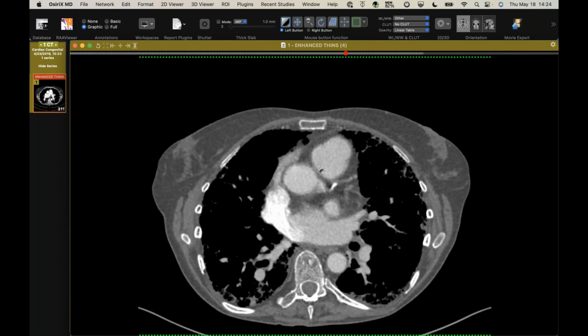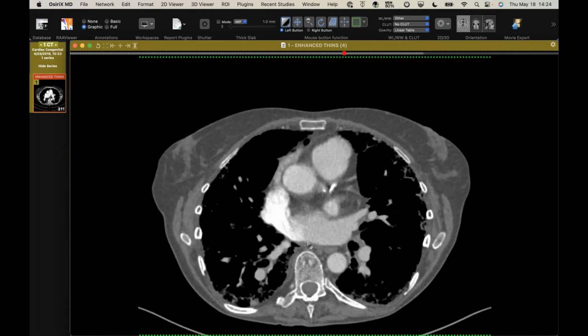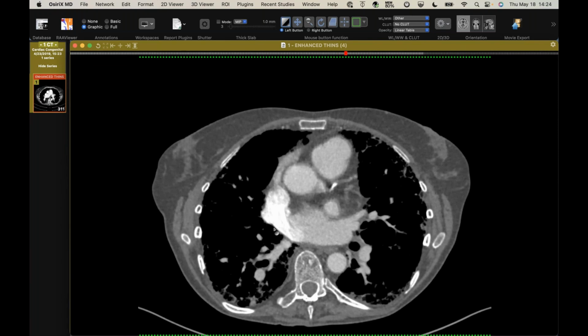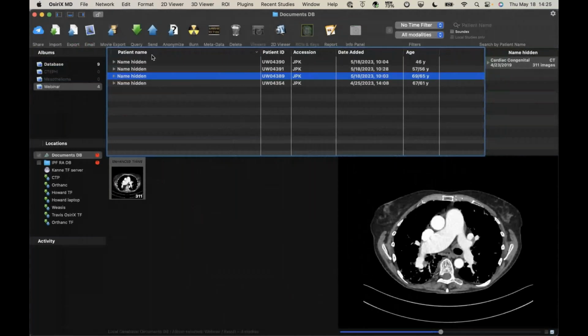So you get an overload, but with this pulmonary hypertension, you can get Eisenmenger physiology, you reverse the flow and you can then shunt back this way. So now you're no longer shunting oxygenated blood, but it's a volume overload. So this is just a typical case, and I'm showing this one because I came across another one that's a little bit different. And that's this patient.